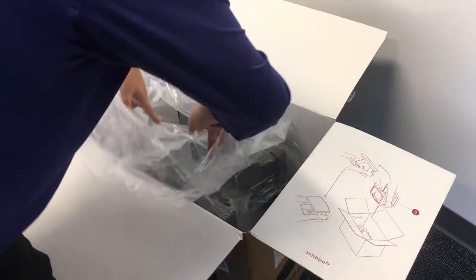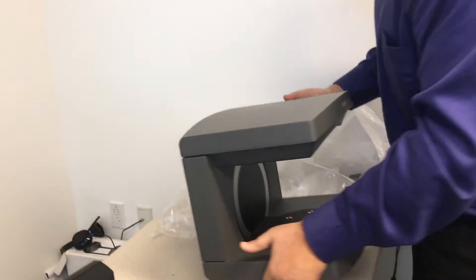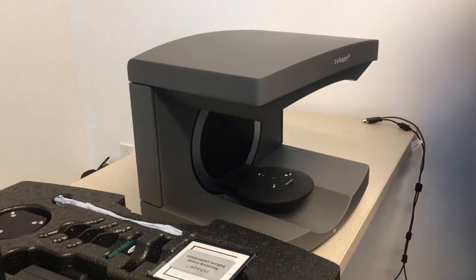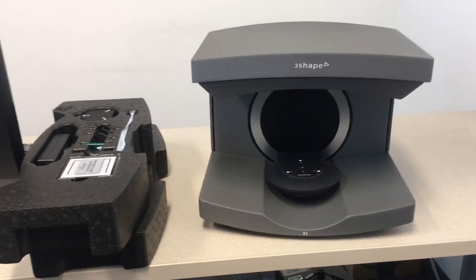Now we're going to pull the actual scanner out of the box. It's got that open scanning section, which makes for nice, easy access — no more having to open and close doors. There is nothing else inside the box, so that's everything we need to get set up. I'm really excited to get this set up and give it a try.